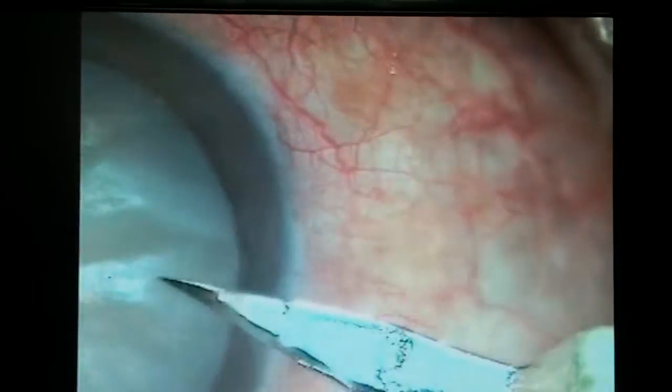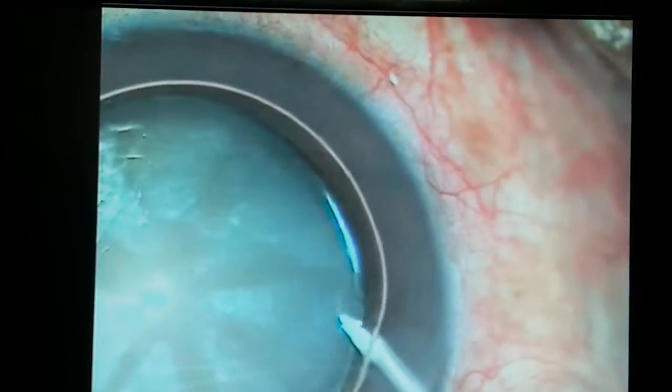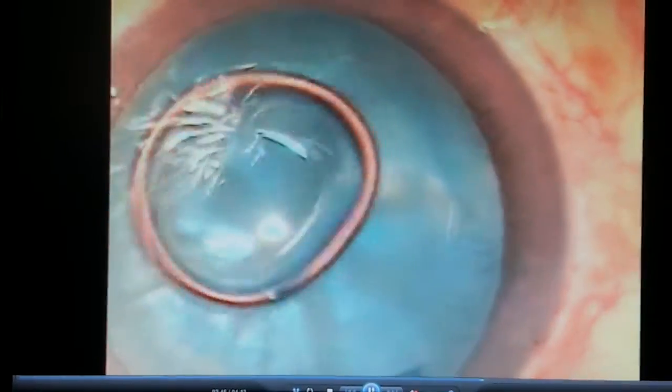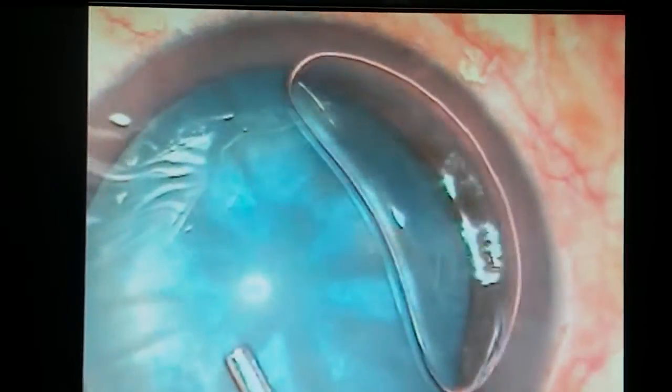With a 2.8 millimeter keratome, another side port incision is made at 9 o'clock. A big air bubble is injected into the anterior chamber. The capsule is stained with trypan blue dye and the dye is washed out.